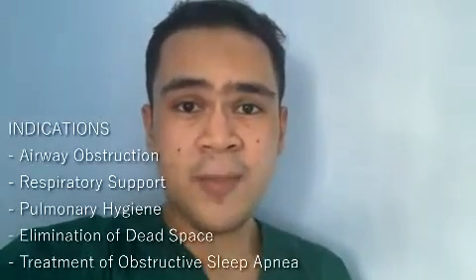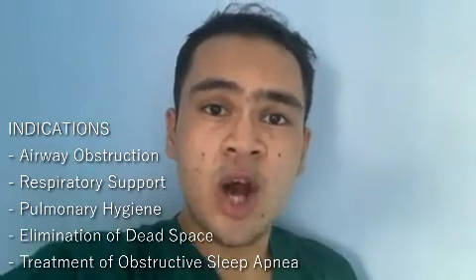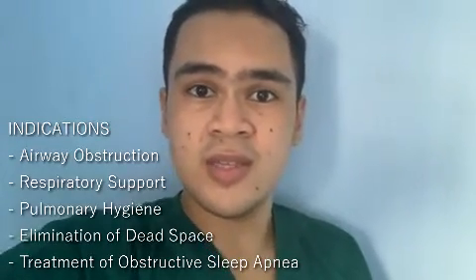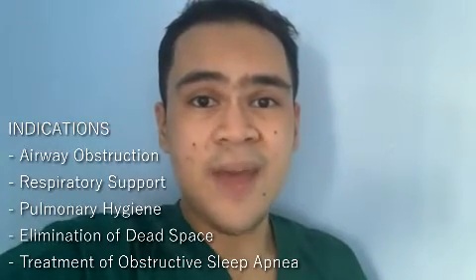It can be used to bypass an airway obstruction, providing respiratory support by delivering oxygen easier to the lungs, performing pulmonary hygiene by cleaning and removing airway secretions, eliminate dead space, and even treatment of obstructive sleep apnea.